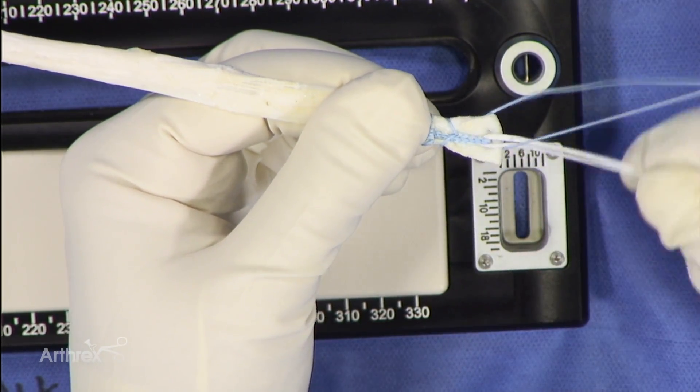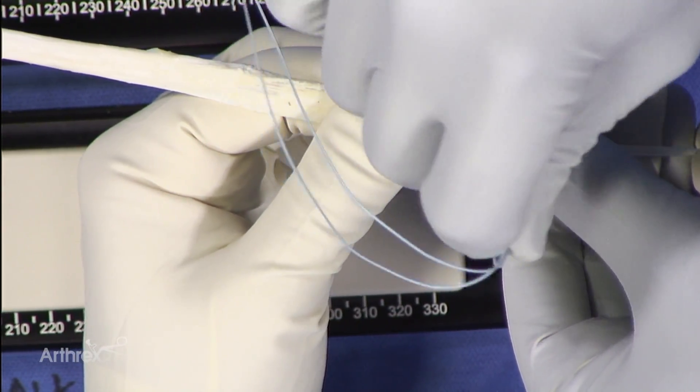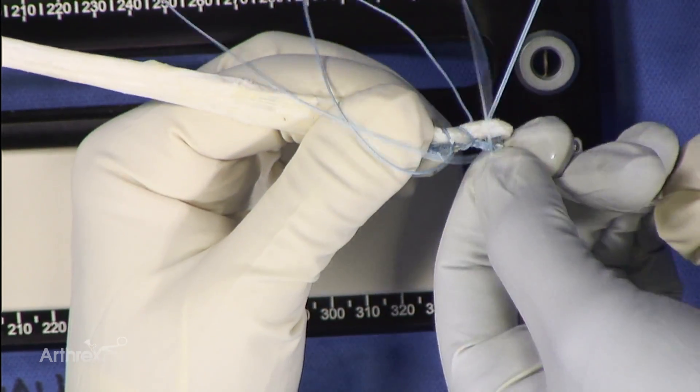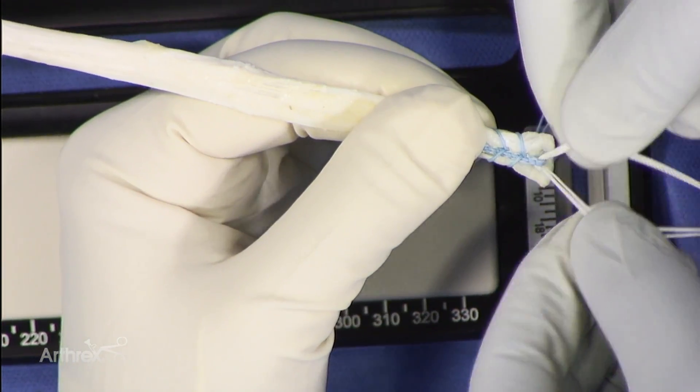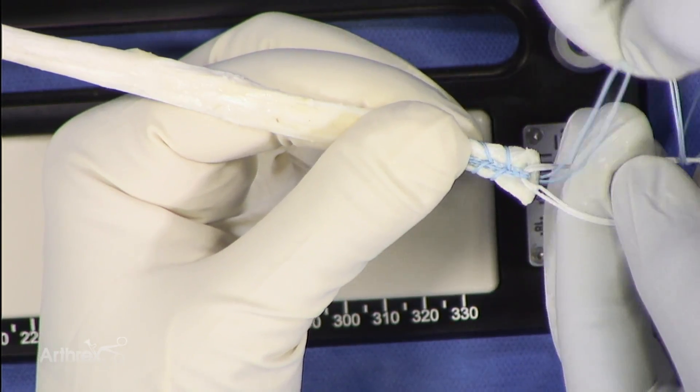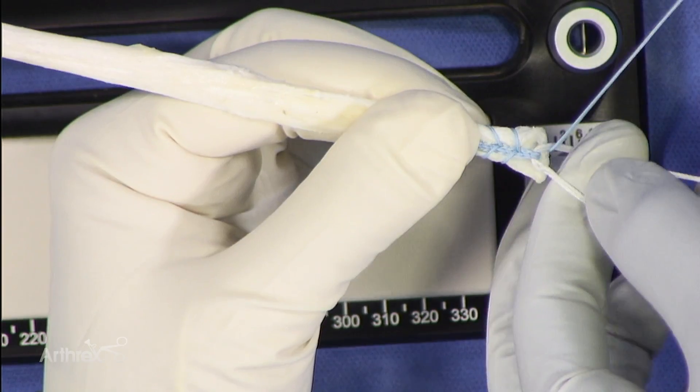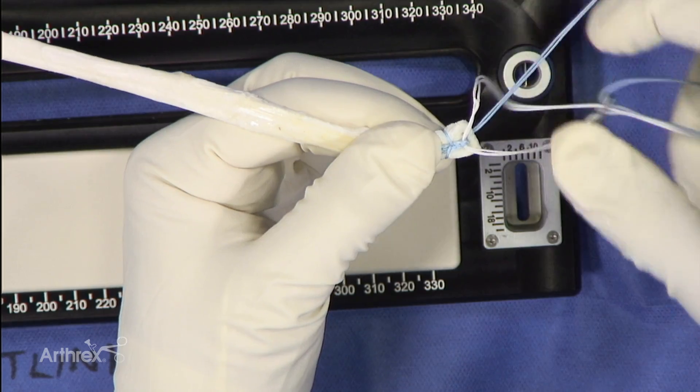And it's very important through this step that you grab the fiber tag each time. Come through again. And now you can see we've captured the RT, but it's not so tight that it doesn't move. It'll still easily move through.